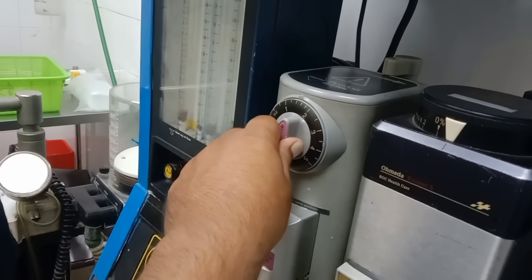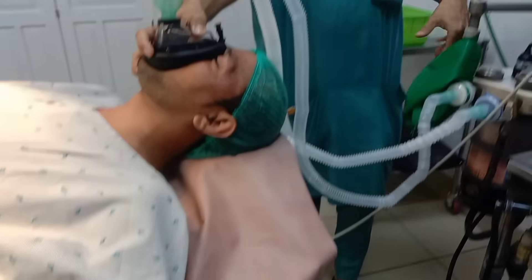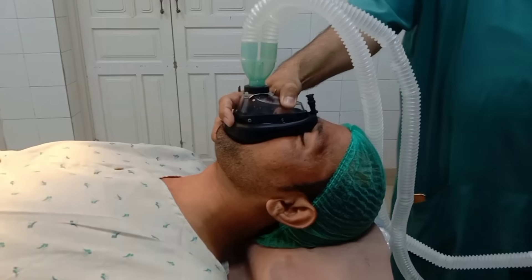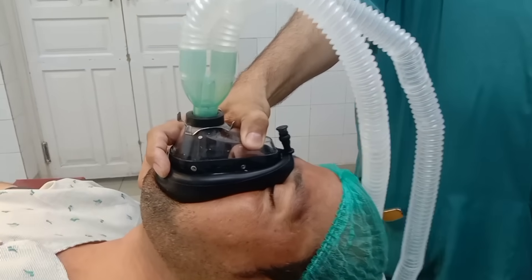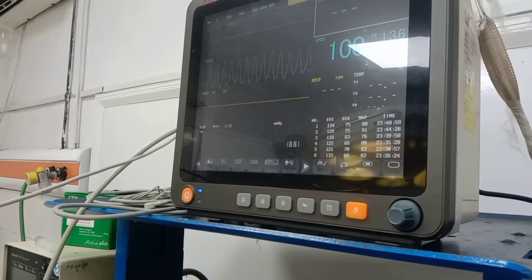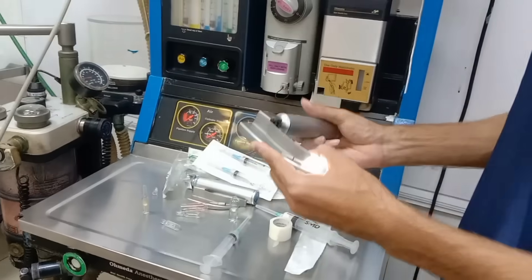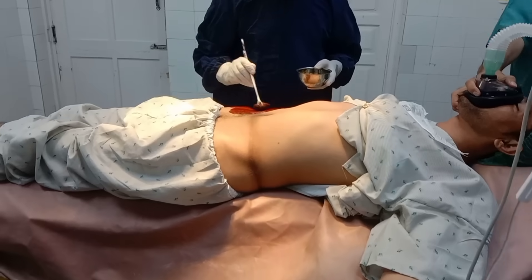Pre-oxygenation. Before giving the induction drugs, I placed an oxygen face mask on the patient and started oxygen delivery through the mask with a reservoir bag attached. I pre-oxygenated the patient with 100% oxygen for about five minutes to build up the oxygen reserve in the body and reduce the risk of desaturation during intubation.